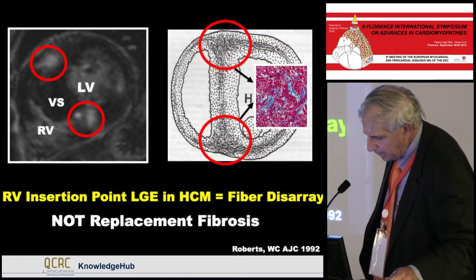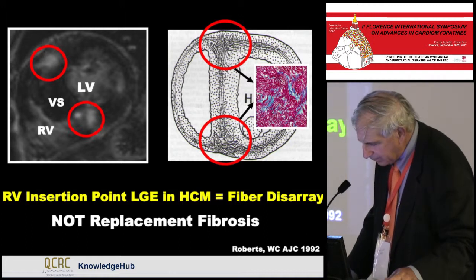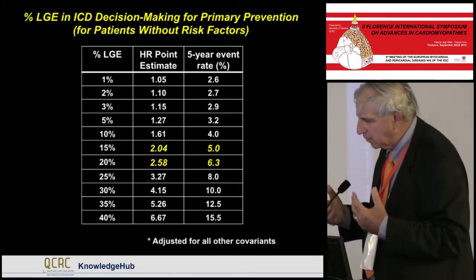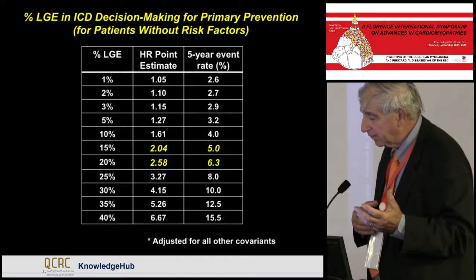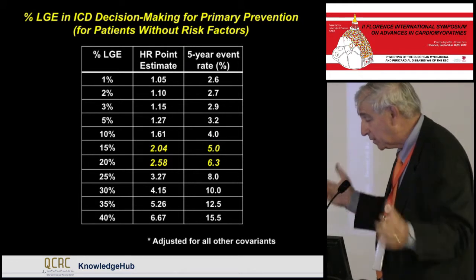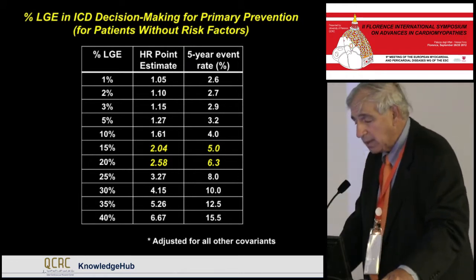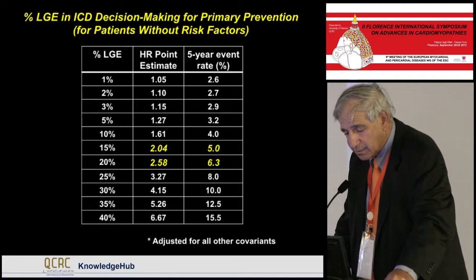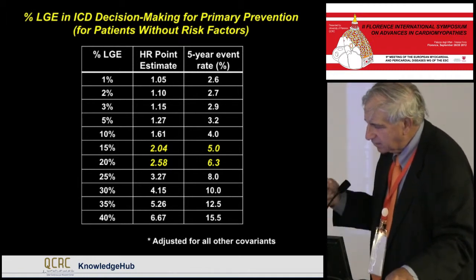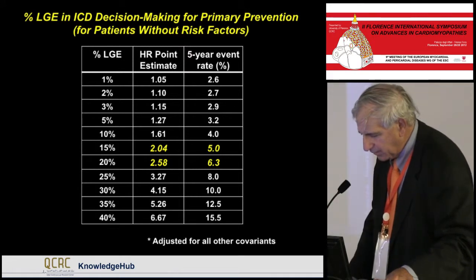And I think also these data really are helpful on the other side of the coin, because the absence of LGE does not immunize patients from the risk of sudden death. There are many mechanisms, and we're not completing the story here. But certainly for the patient population, the absence of LGE has to be considered a favorable feature.